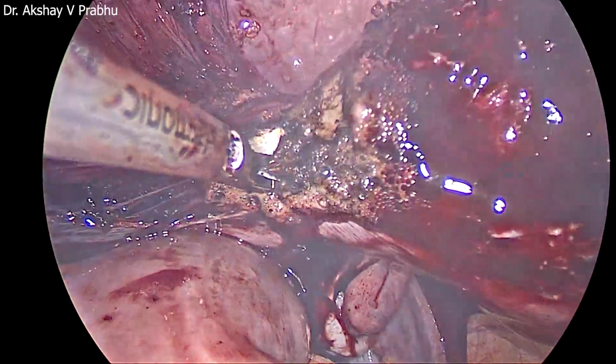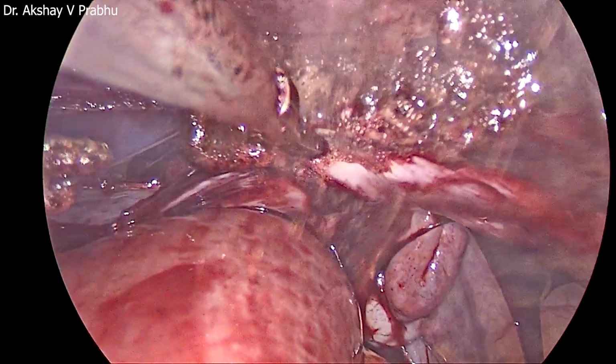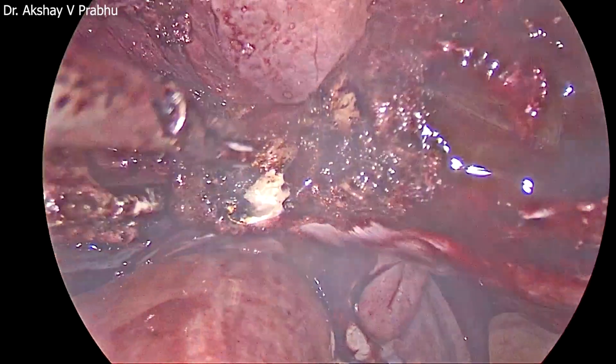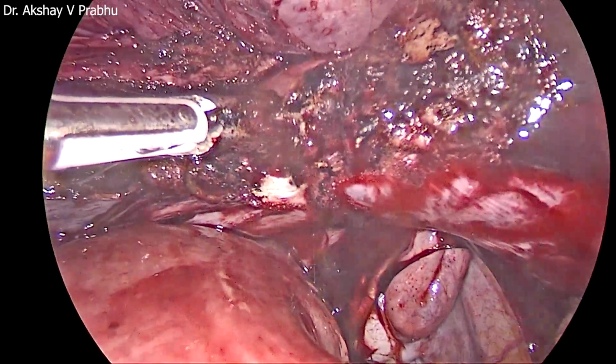I've just asked the assistant to elevate the uterus, antevert it more so that I get some space between the bowel and the uterus. As expected, the uterine was there hiding behind it. As soon as I cut it, there was a gush of bleeding, there was a spurting there. But it's okay, we have taken care of it. Now this is the cardinal ligament.